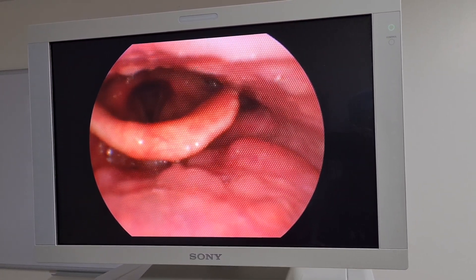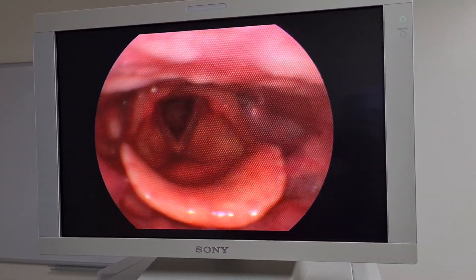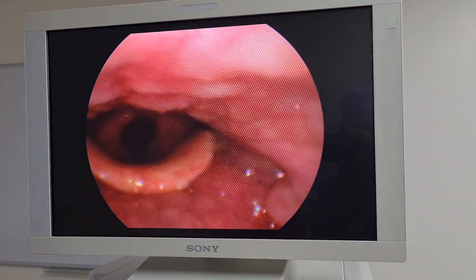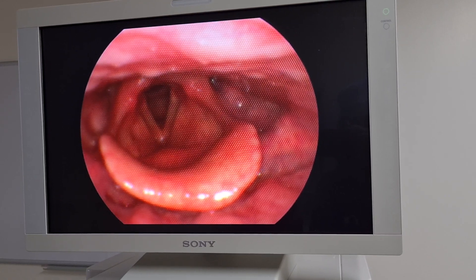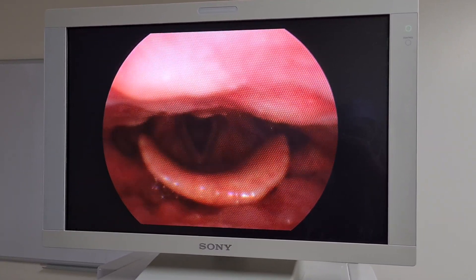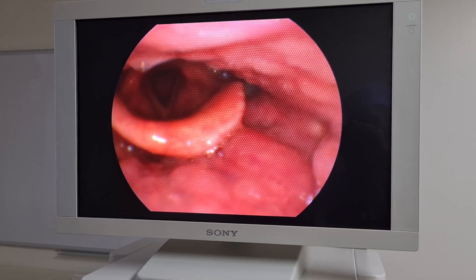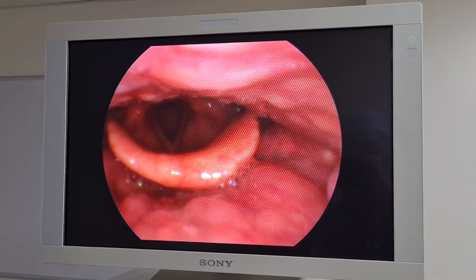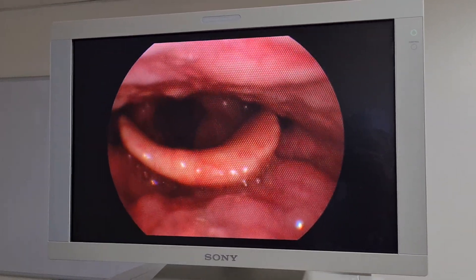As you can see, the vocal cords are moving. Can you bring your jaw forward, Tom? You see it kind of easily opens the superior glottis and gives you a better view of the rima glottis — the gap between the two vocal cords — and that's the rest of the airway there. At the bottom of the picture is your anterior commissure; it looks like a triangle, with the head of the triangle being the bottom of the epiglottis. The arytenoids are at the top of the picture — the two blobby structures — those are the corniculate and cuneiform cartilages. The structure that runs between the arytenoids and the epiglottis is the aryepiglottic folds.